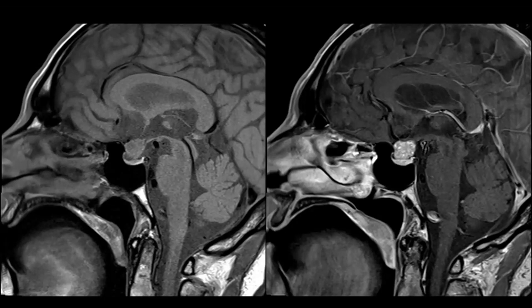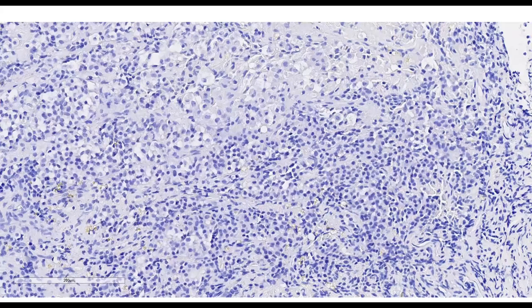That's good. You want to venture a differential diagnosis? I would say that because of the solid appearance and enhancement, I would list in my differential a tuberculum sellae meningioma, I think, definitely not a pituitary adenoma, and I would like to see the restricted diffusion to see whether it may look like a germinoma, or even a lymphoma. I would say those three. Okay, I like it. Very good.